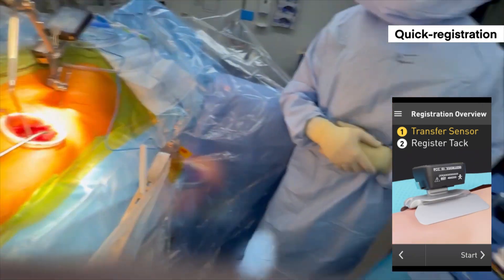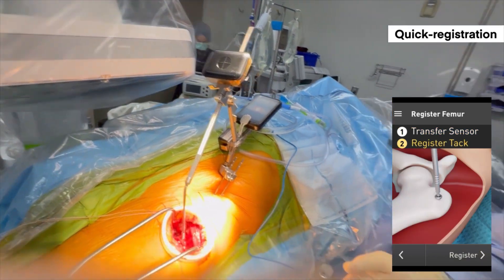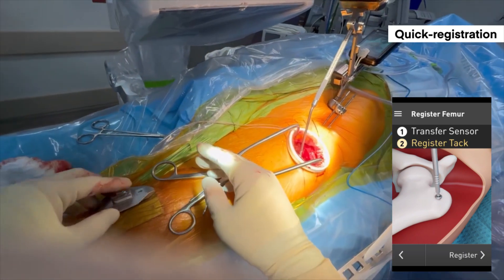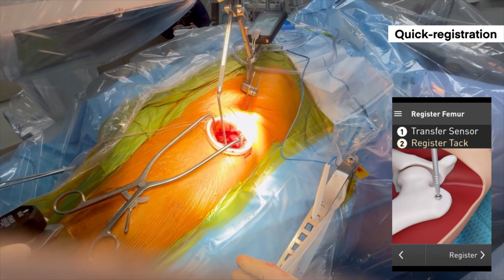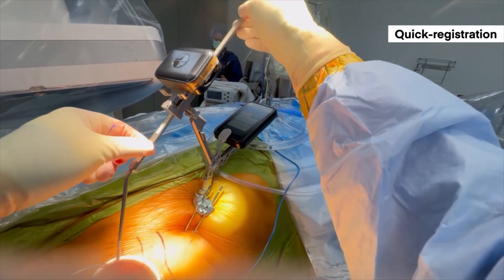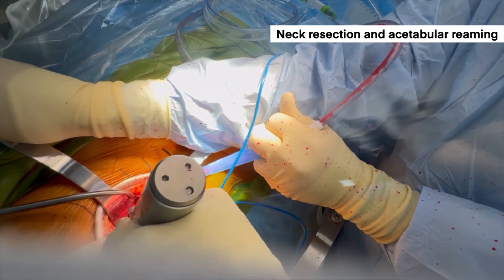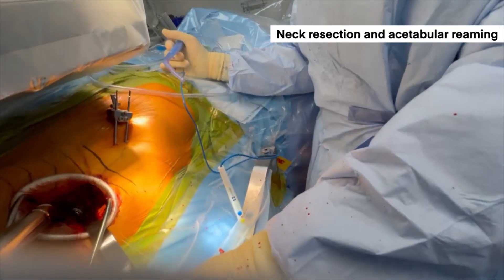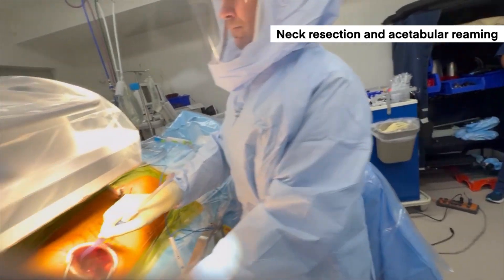The last step of registration is to place the probe onto the femoral tack that we placed earlier, registering the starting leg length and offset position. This attachment goes onto the thigh mount, which has a magnet — it's important to confirm it's firmly adhered. The screen walks you through transferring the sensor to the thigh mount, then placing the probe within the tack and hitting the register button. It's important to support the base of the Lantern Hip system every time you press the button to ensure no motion. I continue with femoral neck resection and acetabulum preparation per standard technique. Lantern Hip has allowed me to significantly reduce the amount of fluoroscopy I use, and others remove fluoroscopy altogether.